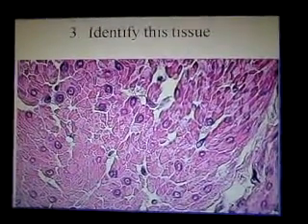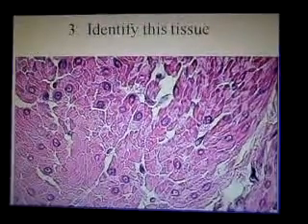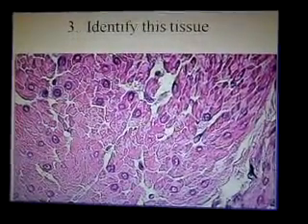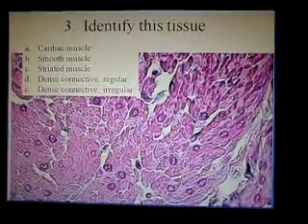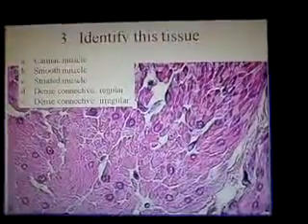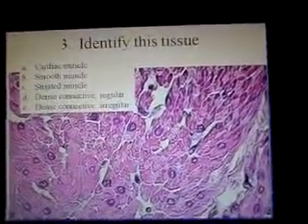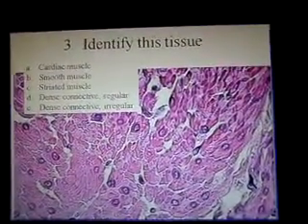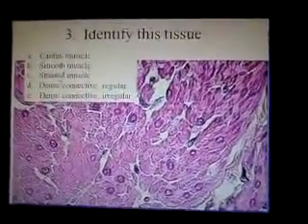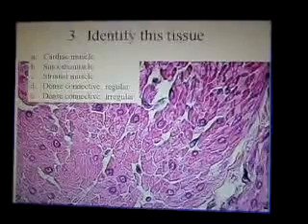Again, the characteristic features of this are the nucleus in the center, but with a small amount of cytoplasm. No striation in the cytoplasm whatsoever. Some of the profiles have no nuclei. Matter of fact, most of the profiles show no nuclei. Typical of smooth muscle in cross-section. Okay, so this is smooth muscle cross-section.